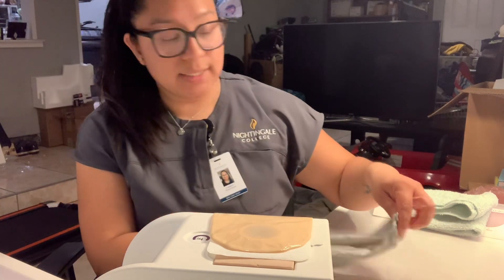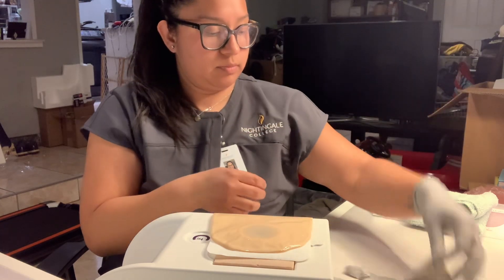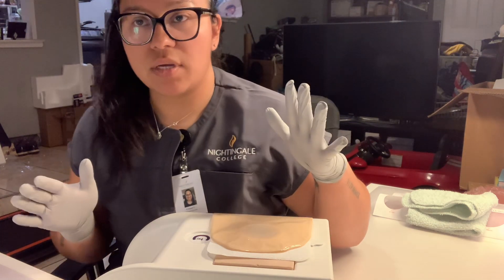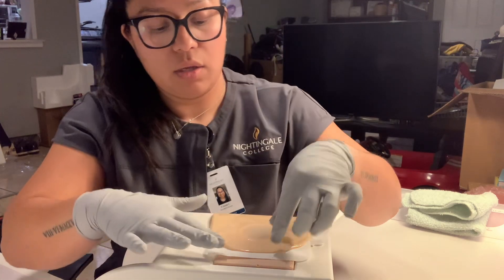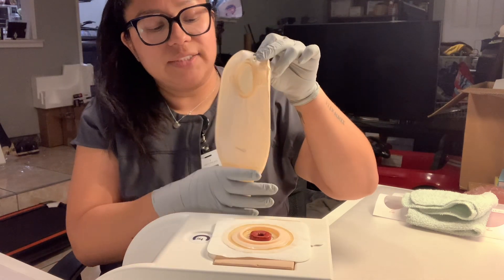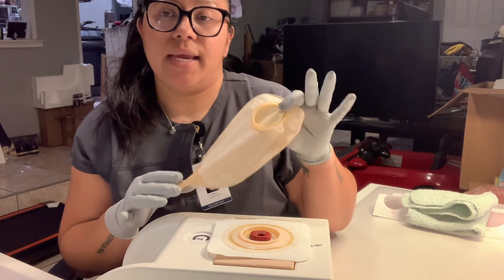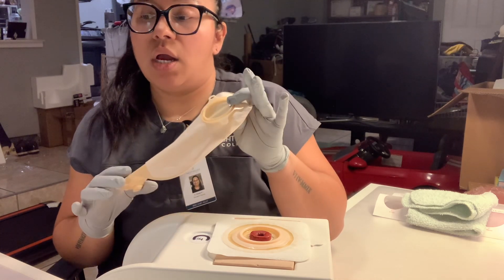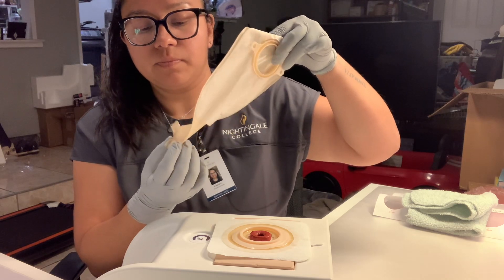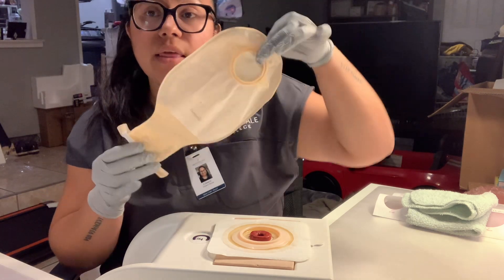I'm going to start by putting on clean gloves. Now that my gloves are in place, I'm going to first start by removing Mr. Conde's colostomy bag. We would empty out the contents if there were to be any — the contents would go in the toilet. If there's an order for strict intake and output, we would measure the contents in either a cylinder or a hat in the toilet. We open the bag by removing the snaps from the bottom. This would not go in the trash.